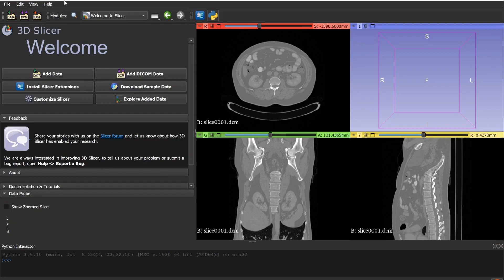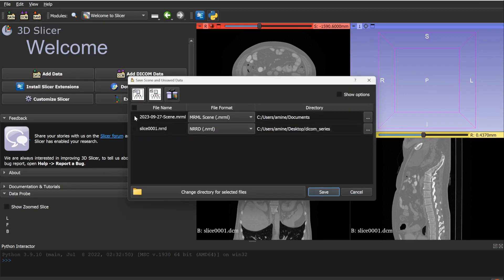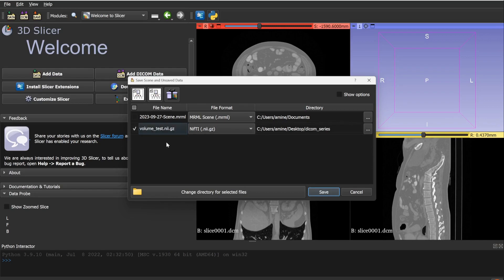Once the DICOM is loaded, go to Save and check the volume file. Give it a name like 'volume_test', then select the extension — either NRRD, NIfTI (.nii), or NIfTI compressed (.nii.gz). Choose where to save it, click Save, and the file will be saved. That's how you convert from DICOM to NIfTI or NRRD.